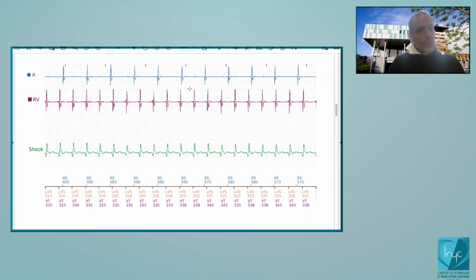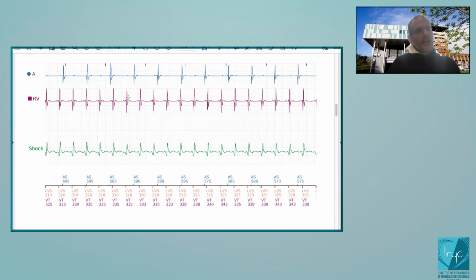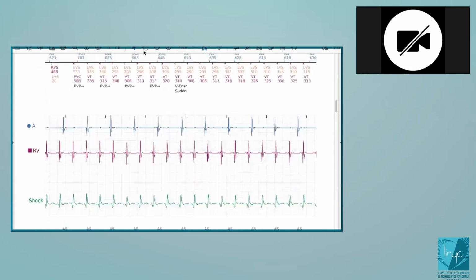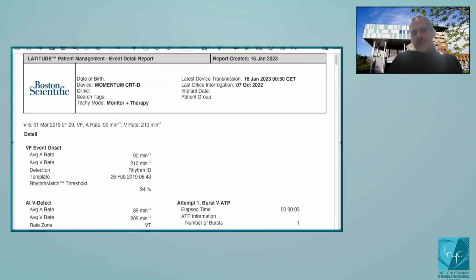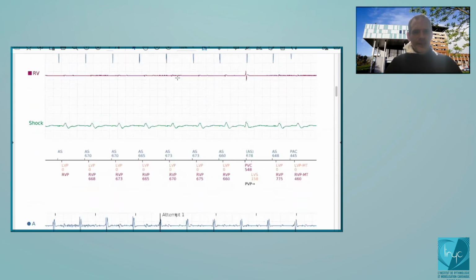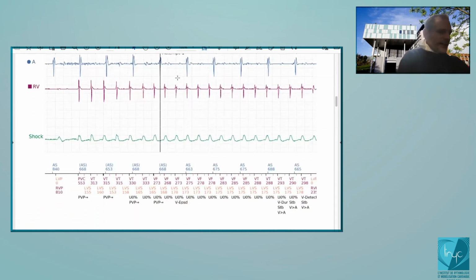I think you can probably prolong the duration inside the VT zone a bit more, to avoid as much as possible treatments that are avoidable, because there could be a spontaneous reduction of the arrhythmia. You understand that? Clear? Yes, all clear. Okay. So maybe we could program even longer. What do you think here?